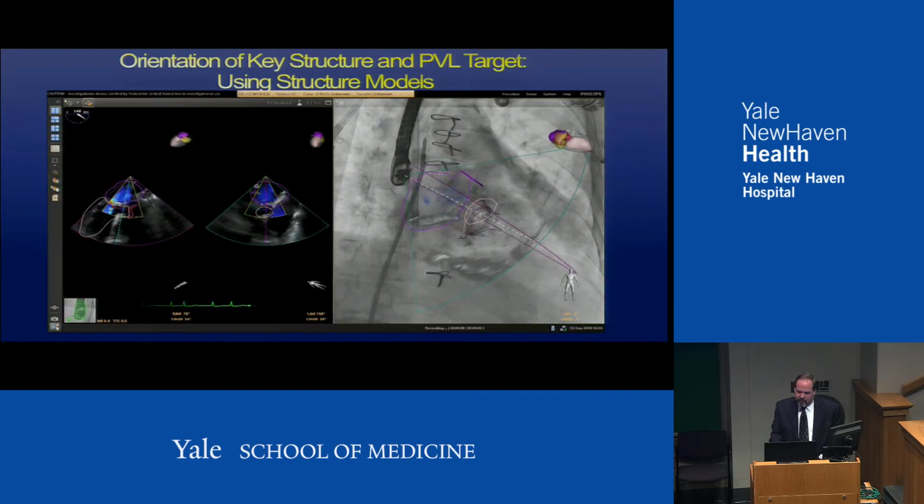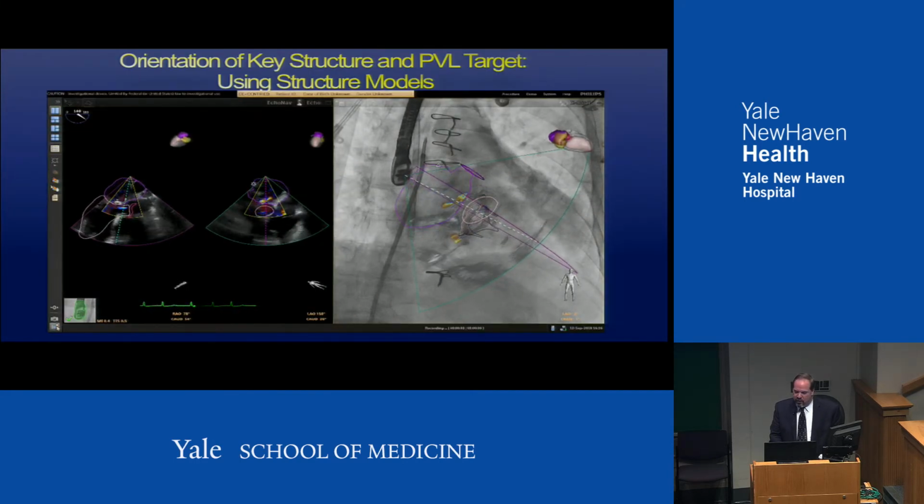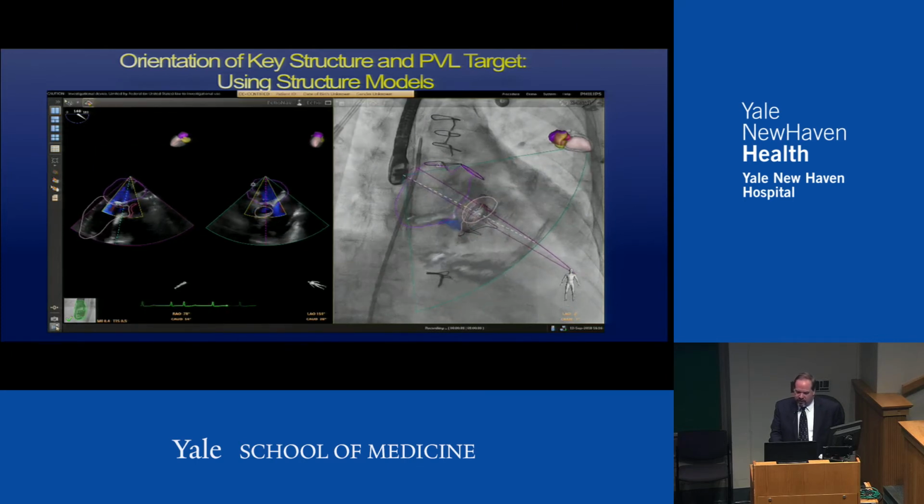So here we are doing the transeptal puncture, with models, not a big deal.